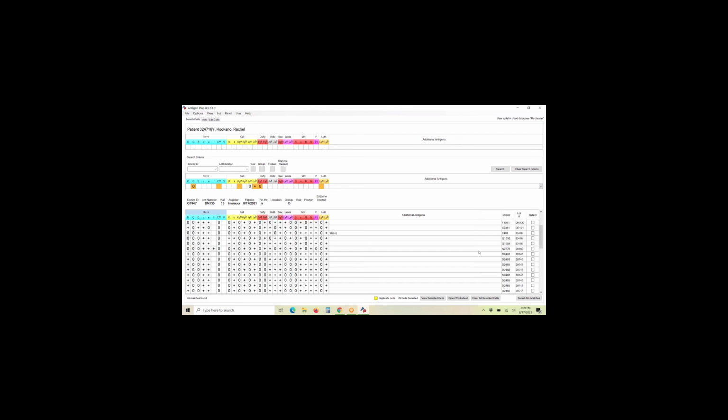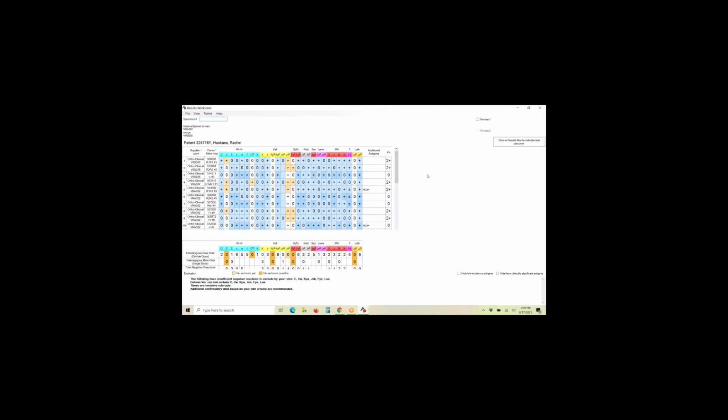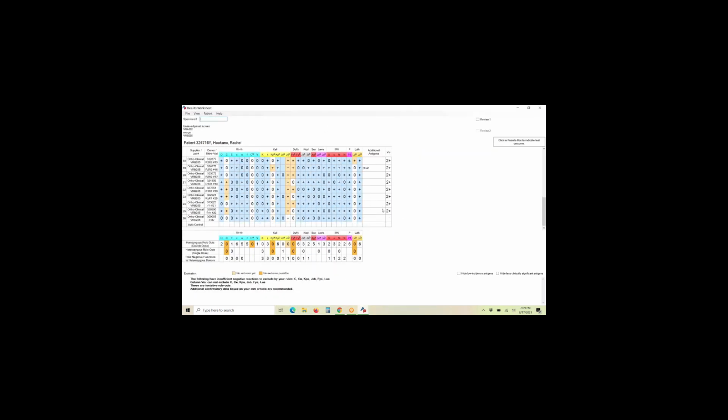So we can see if we can find any Vision cells. No, that's not. This looks like a Vision probably. So now we can go back to our results panel. And some more things are going to happen. There's going to be no place to result it because we cannot result here. It won't let me in there because this is an automated one. So we're going to have to add a result column.